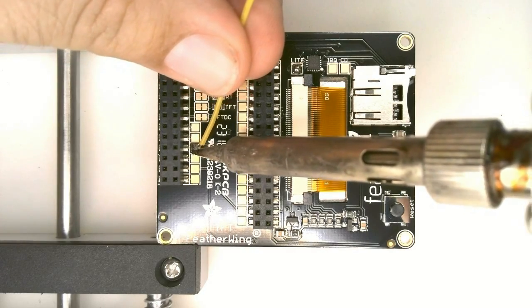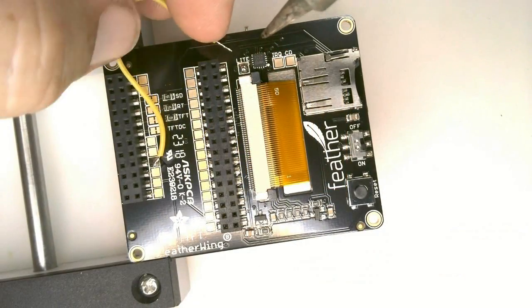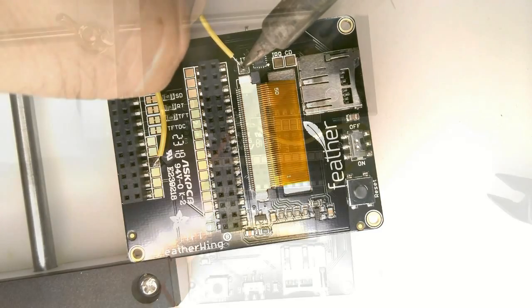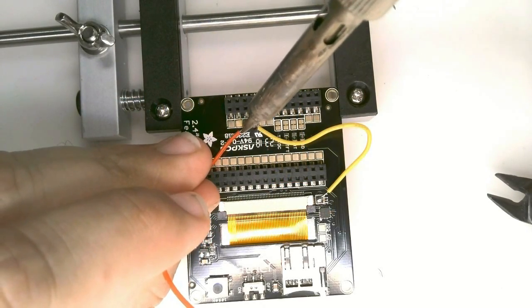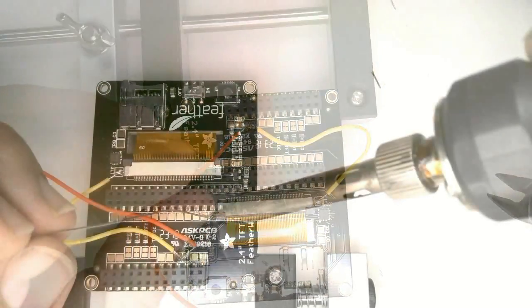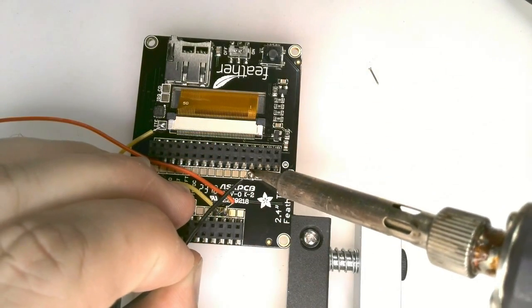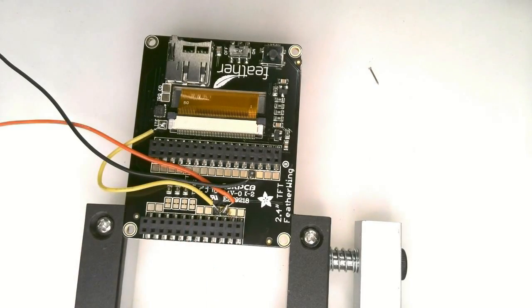Then reheat the solder on the pad and attach the wire to pin 13 and the other end to the light. The red wire goes to the USB pad just adjacent to the yellow wire on pin 13. The black wire goes on the other side on the ground pin, fourth pin from the right. That completes assembly of the TFT board.